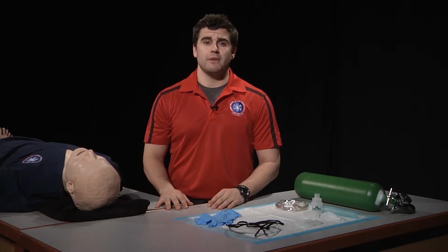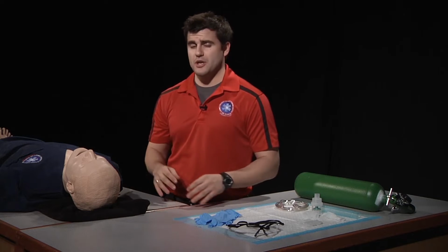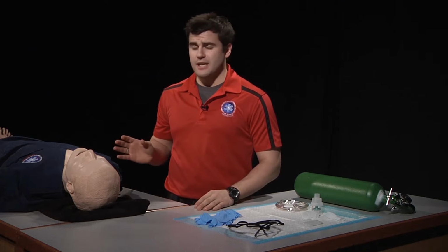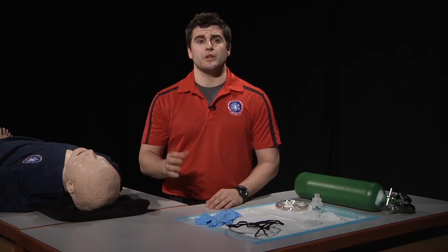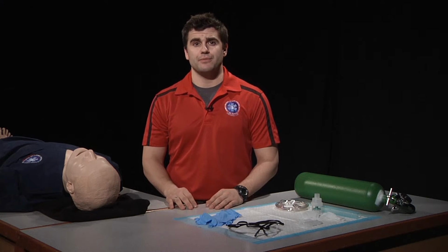This is the inhaled medication administration skill. The first thing we want to do is make sure our patient is being ventilated appropriately. From there, we want to make sure the patient has no allergies to any medications that we could be administering. And also, we want to clearly explain the procedure to our patient.